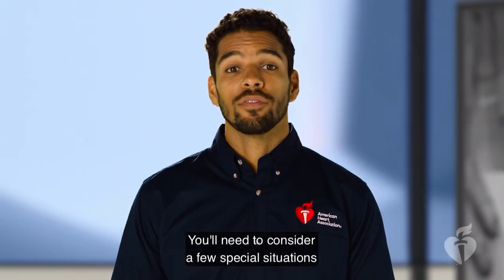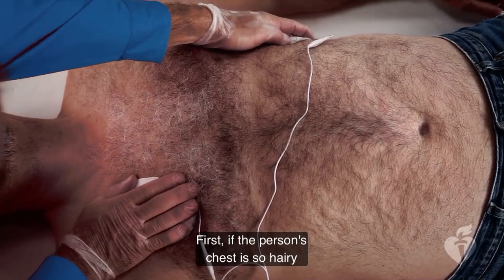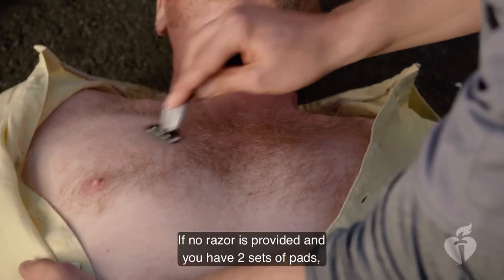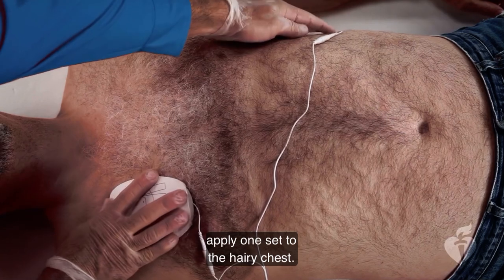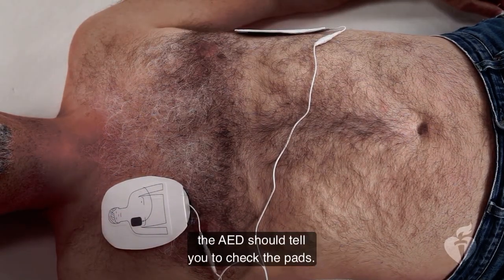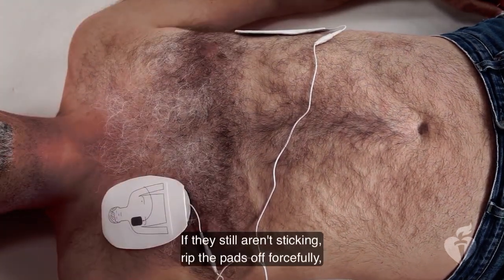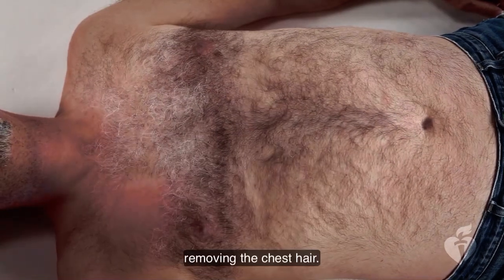You'll need to consider a few special situations when using an AED. First, if the person's chest is so hairy that the pads can't adhere to the skin, you may quickly shave the area if a razor is provided. If no razor is provided and you have 2 sets of pads, apply 1 set to the hairy chest. If the chest hair prevents the pads from contacting the skin, the AED should tell you to check the pads. If it does, press them down more firmly. If they still aren't sticking, rip the pads off forcefully, removing the chest hair.